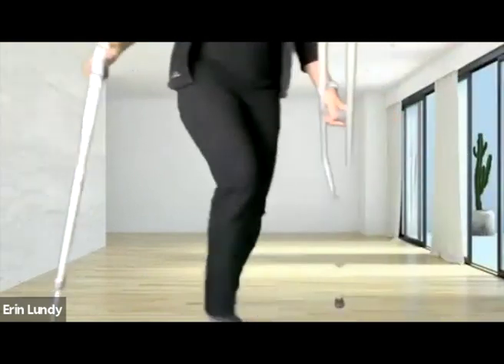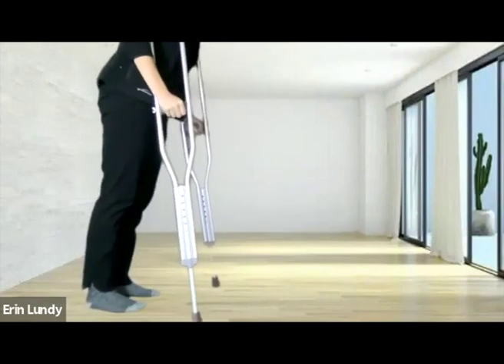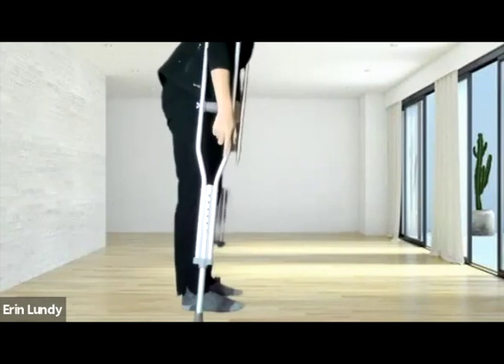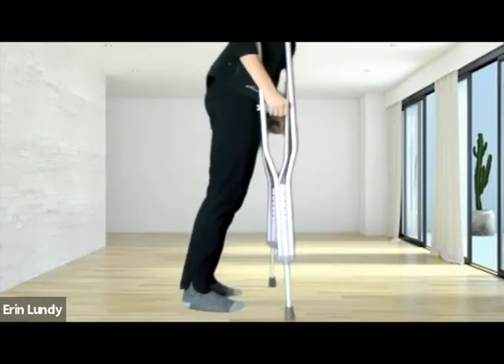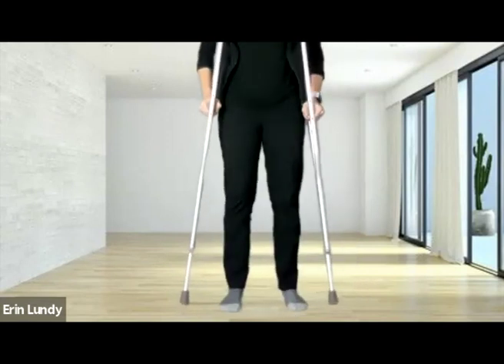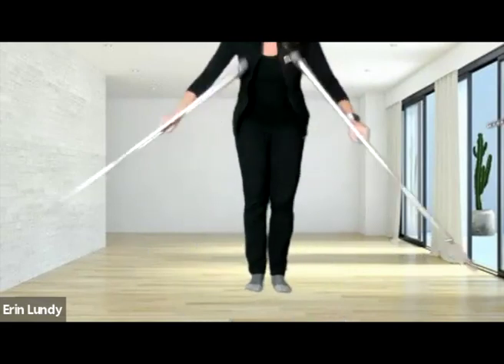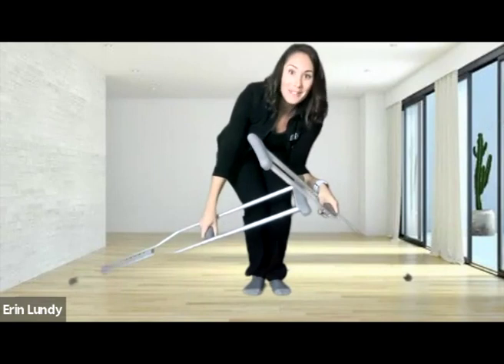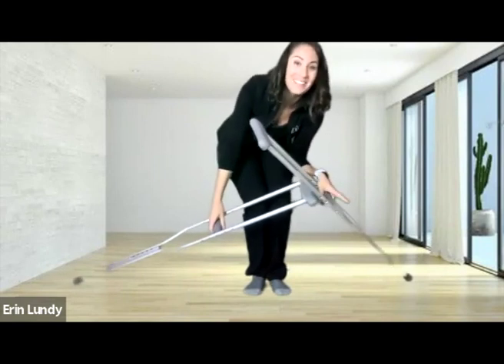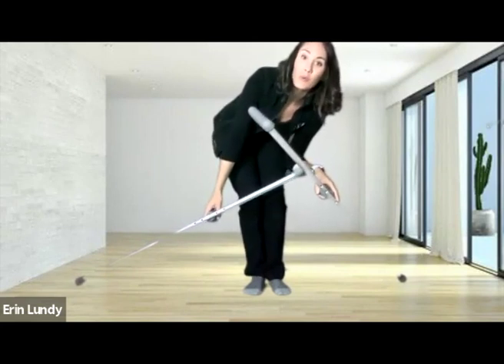So we're going to start with swing to. That basically means you're going to have your crutches in line like this, and you're going to have both feet swing to the plumb line of the crutches. Crutches forward, swing to. And I'm moving both legs forward like so. Okay. And I typically would recommend this for kids that are a little bit more coordinated and have no problem doing this.